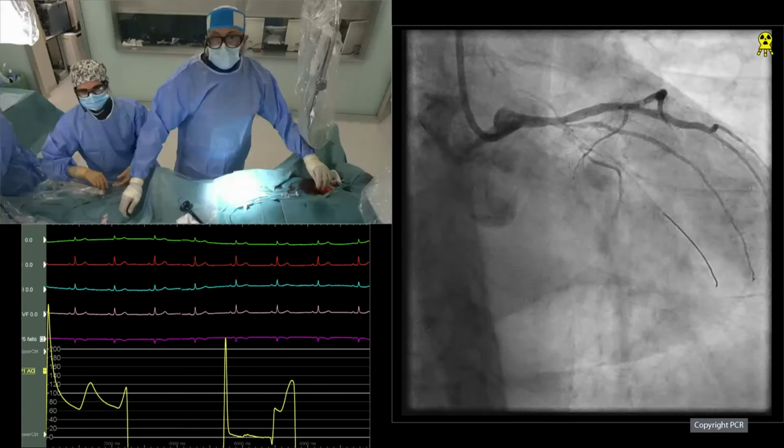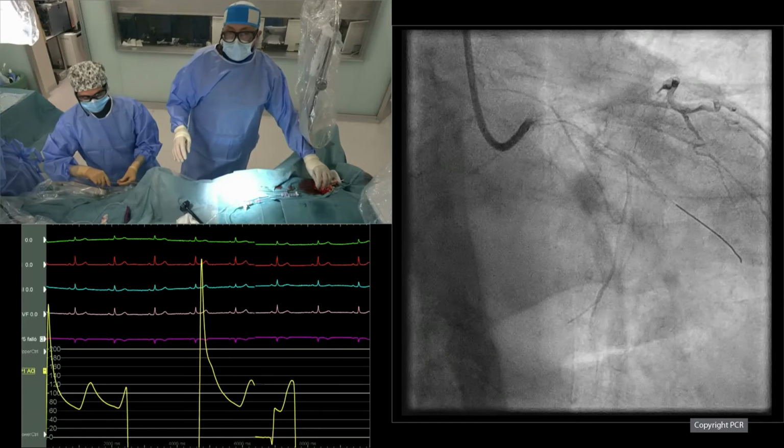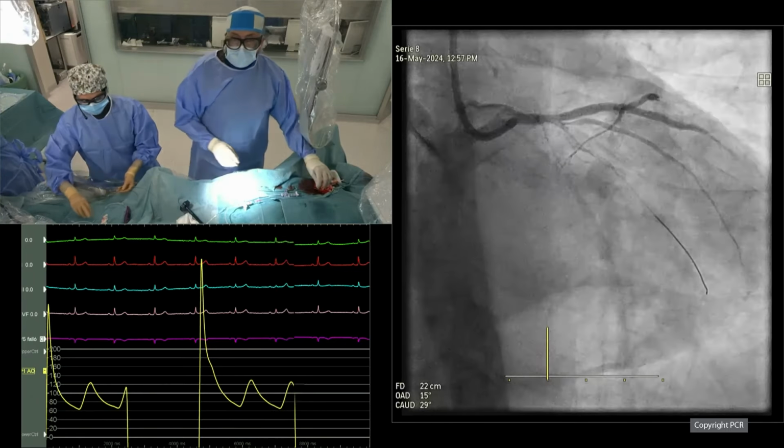Okay. So the vessel at this point is a bit occluded, and what we're going to do, before doing OCT, give me a balloon. We are going to perform a balloon dilation, and also give some nitrates. So we certainly did some plaque modification there. So we need to get it back. The balloon of 3. A balloon of 2.5. It's on the table. Nitro, please. The balloon. So we will give a bit of nitro just to make sure that the side branch is well preserved.